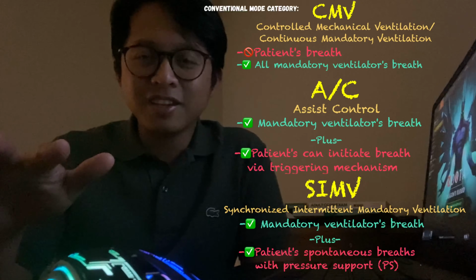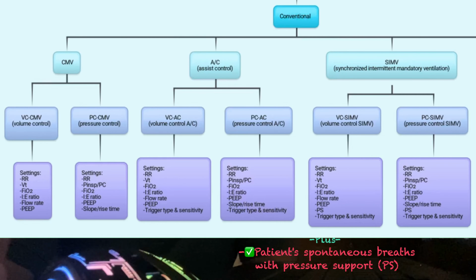My point here is that all of these modes are the same if the patient has no breath, effort, or contribution to the process. They all have a preset breath that is given in a preset cycle. What I don't understand is that people try to break down this mode into 6 to 9 modes, when in fact these 3 modes are the same if the patient has no spontaneous effort or trigger. They all give the same preset breath, right?